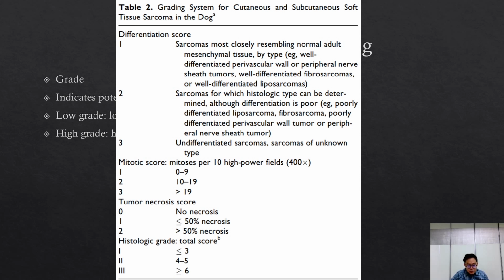We will use other factors such as how many mitotic figures there are in the tumor, is there necrosis, how much variability is there in the nuclei, or are there cells with more than one nucleus, which shouldn't happen in most cell types. It's a sign of serious neoplastic change.